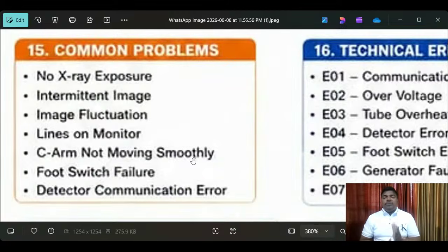Sometimes if that is not possible, you have to go and check everything first: power supply, PCB and MCB, all connections, and whether all parts are okay. Next, check whether all settings are okay, then restart the equipment with the permission of the technician. That is very important. Without conversation with the hospital staff, don't do anything, because this is live monitoring equipment and the case may be postponed. The operation is waiting, so don't take any individual actions. If you are confident, communicate, find out the issues, and try to resolve them.